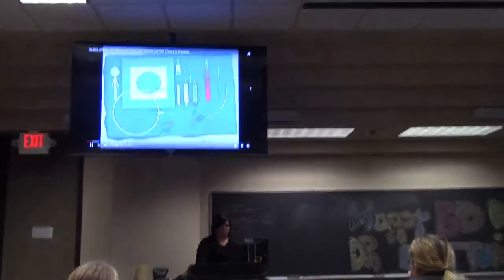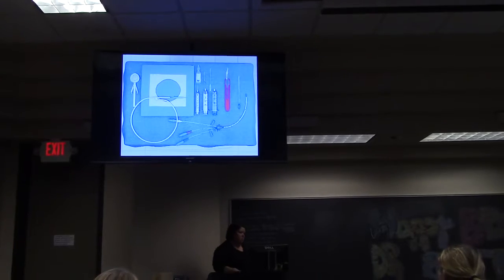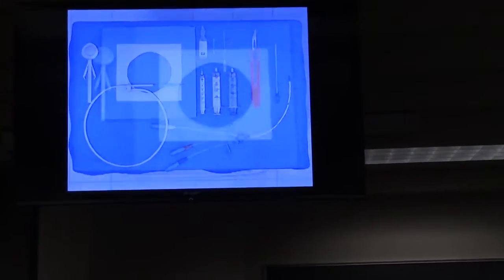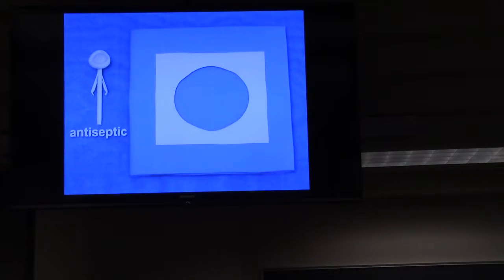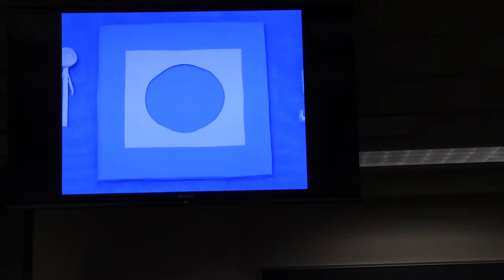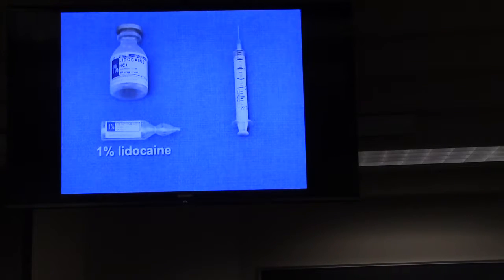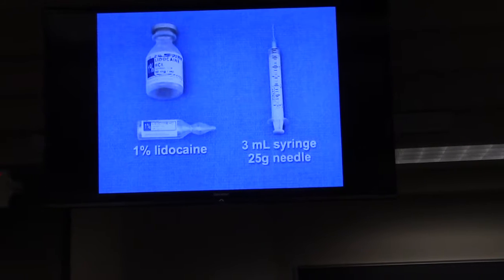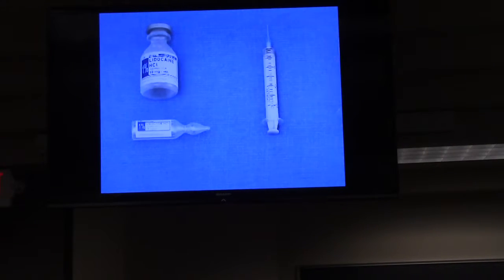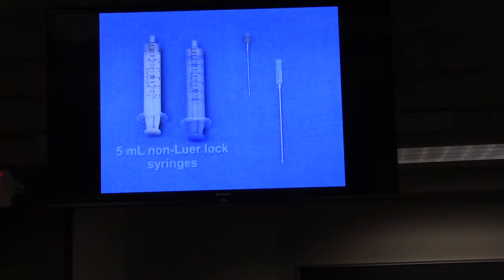Although the specific contents of a central line kit will vary by manufacturer, it will usually contain the following items: a chlorhexidine antiseptic applicator and a large sterile drape or half sheet for sterile preparation, 1% lidocaine and a 3 milliliter syringe with a 25 gauge 1-inch needle for local anesthesia, several 5 milliliter non-Luer lock syringes which are used for aspiration during the insertion, a variety of needles.